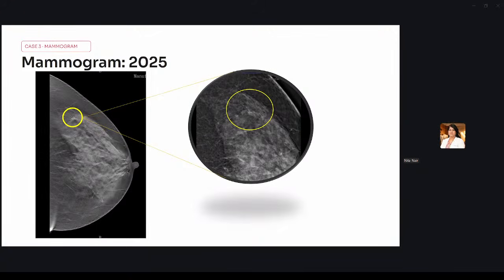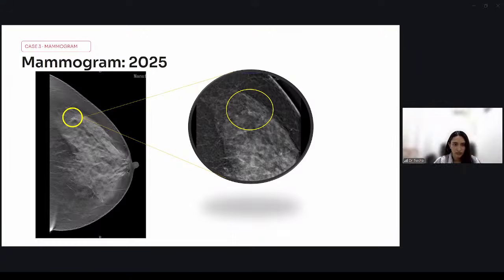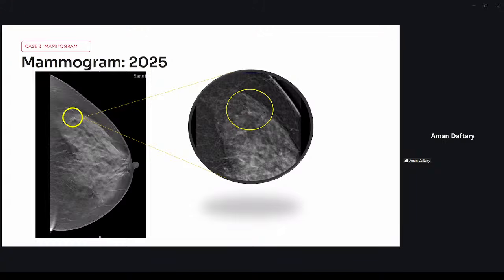Is there anything else we could do? No, she's allergic to contrast. She's probably allergic to MRI contrast, and definitely allergic to the contrast we use in contrast-enhanced mammography. Do a tomography, a dedicated one. They did mention two lesions on the ultrasound.